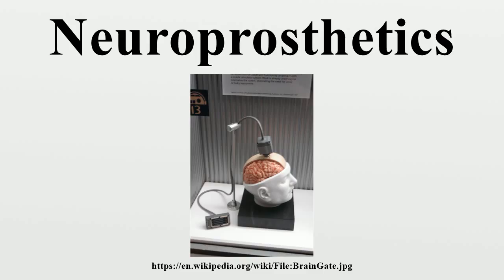After decades of research in monkeys, neuroscientists have been able to decode neuronal signals into movements. Completing the translation, researchers have built interfaces that allow patients to move computer cursors, and they are beginning to build robotic limbs and exoskeletons that patients can control by thinking about movement. The technology behind motor neuroprostheses is still in its infancy.